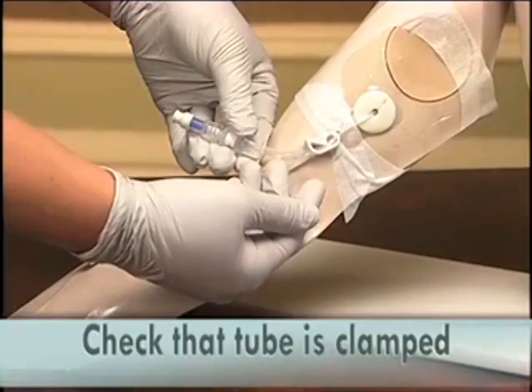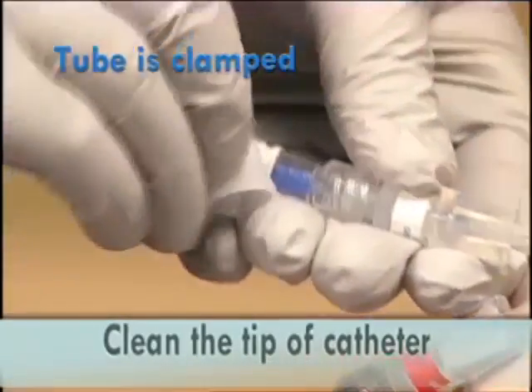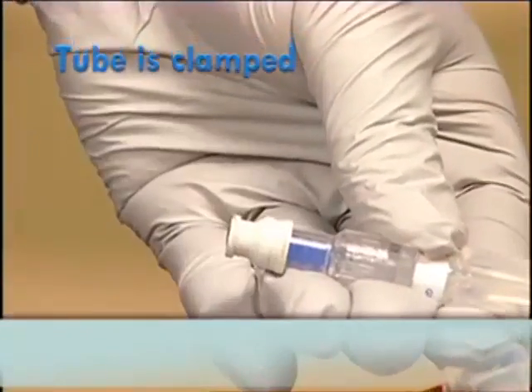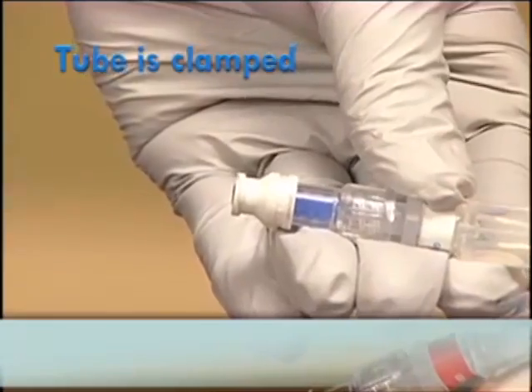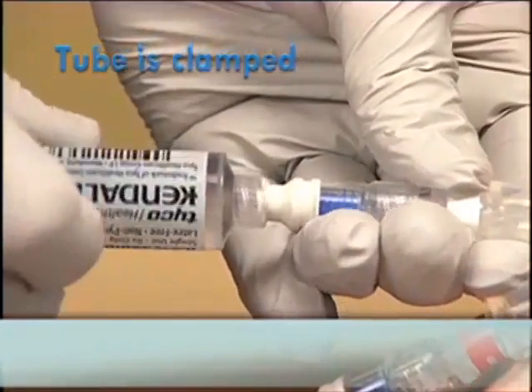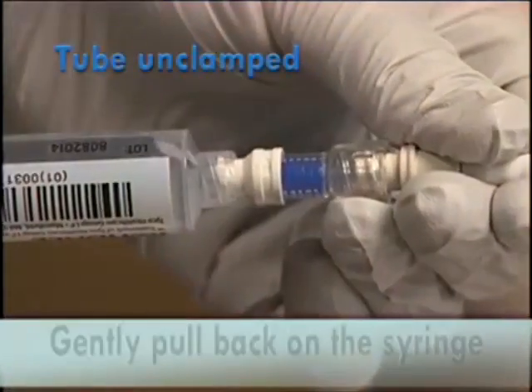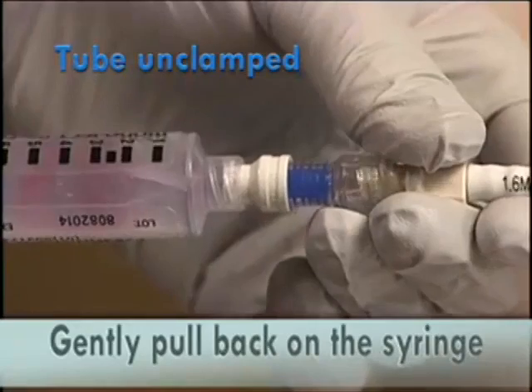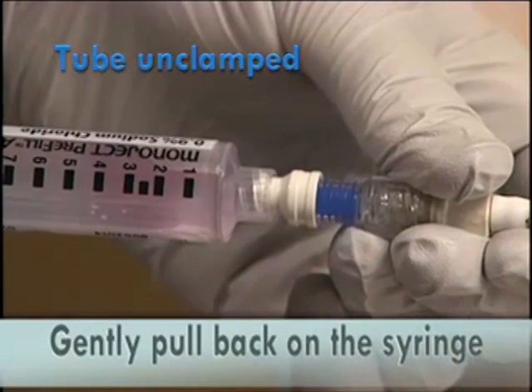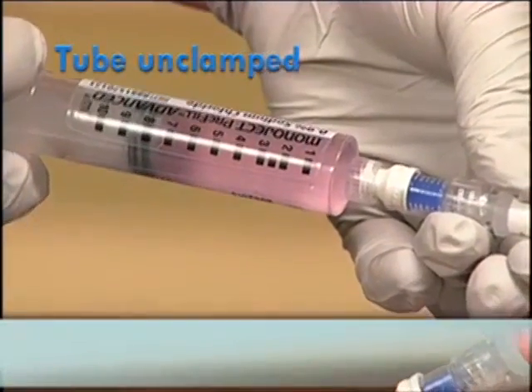Check that the tube is clamped. Thoroughly clean the tip of the catheter with the alcohol pad and hold on to it to prevent contamination. Insert the tip of the syringe into the catheter. Unclamp the tubing. Gently pull back on the syringe until you see a flash of blood. This ensures that there is no air in the line.